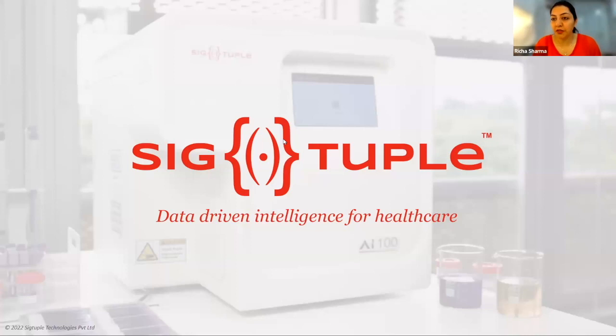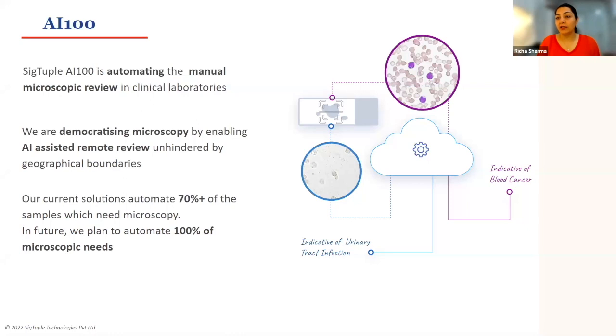I'll just briefly introduce the device, which is AI100, and it's a digital morphology analyzer. It has been developed by a company, SigTuple. It's a homegrown company based in Bangalore, and it works in the segment of tech. So this is a device which is trying to automate the entire manual microscopic process that happens in clinical laboratory.